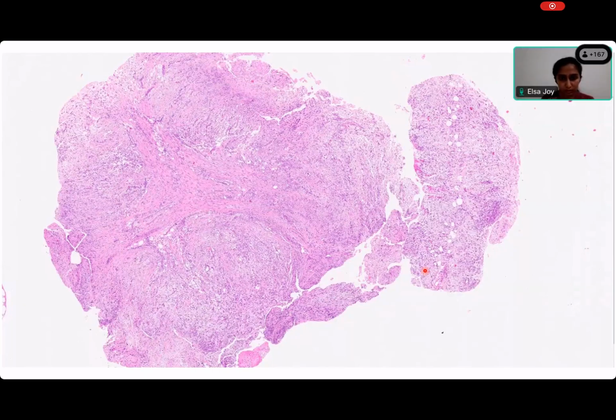Ma'am, section shows. What do you want to say at low power? Just your general impression at low power. What do you see? Ma'am, nodule separated by a cellular lesion. Yes, so you have nodules. Very good. Excellent. You have nodules.